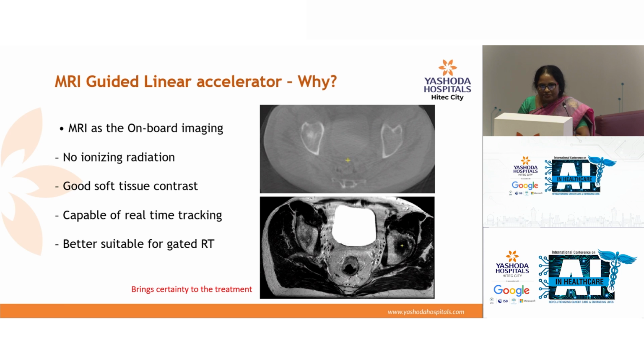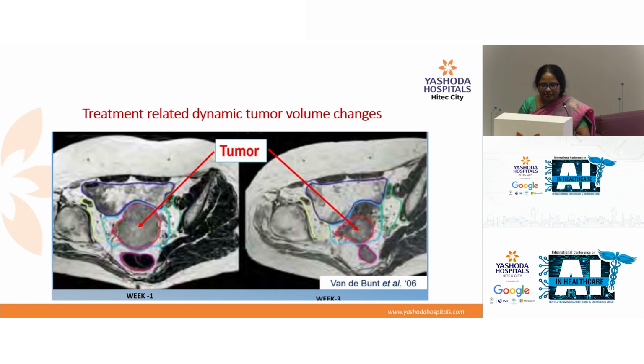So we are doing a replanning and recontouring every day, so the side effects are very, very less for these patients. Also, it is not only about the normal or critical structures. During radiation we see that sometimes 50-70% tumor reduction will be there. Suppose this is a locally advanced cervical cancer.